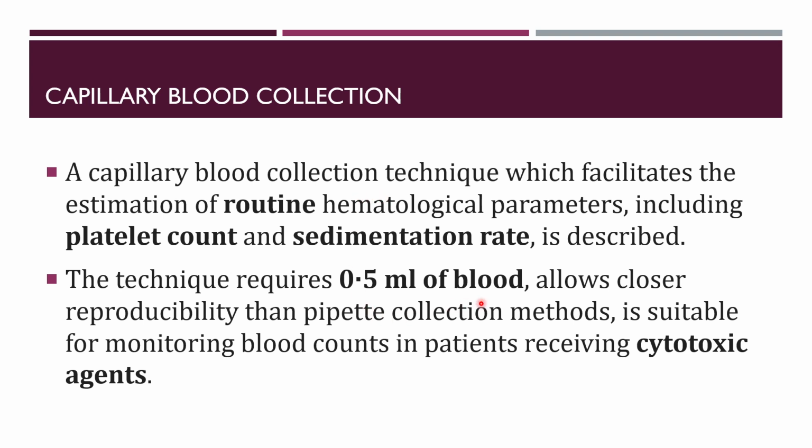Because the amount of sample which is required is very low, only a few of the tests can be done from the capillary method. Also, this method is not widely accurate. It may consist of some variations or errors because the amount of blood is very low. Sometimes you may be able to take some amount of sample, and sometimes it requires a specialized pipette to measure the amount.